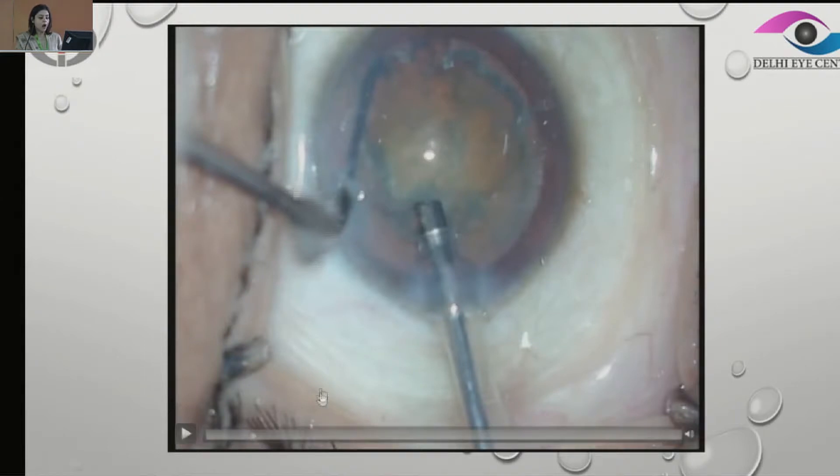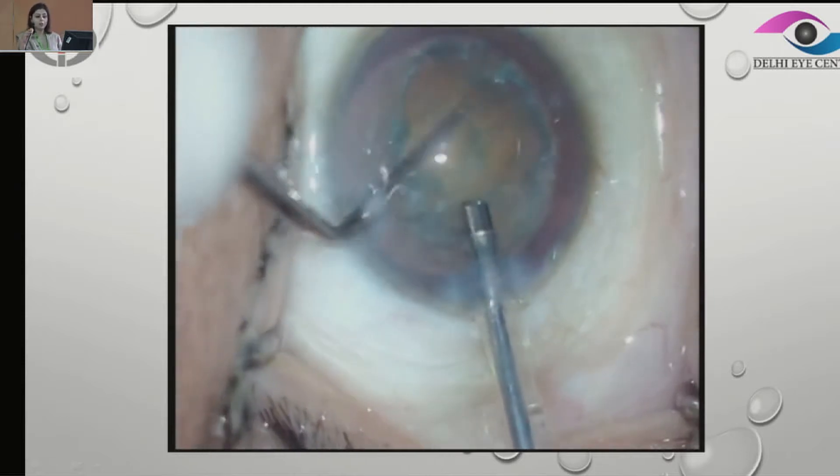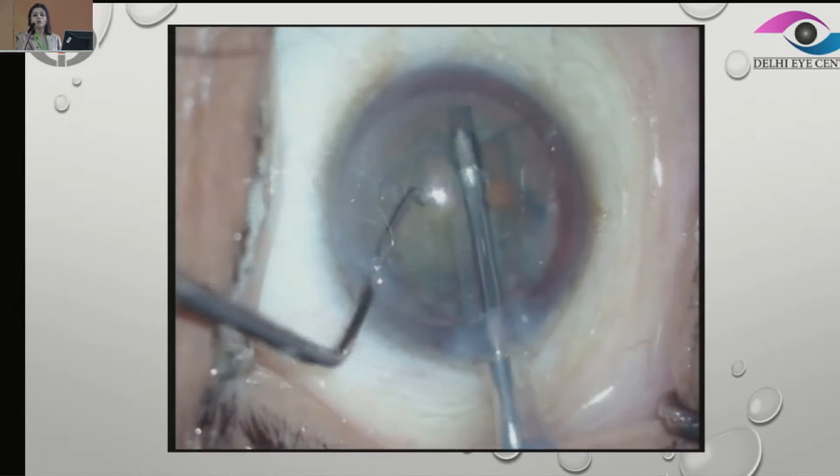So let's see how we can deal with these cataracts. This is one of the videos — it's a soft cataract in a relatively younger patient. What we are doing here is rotating the nucleus and making sure that apart from removing all the loose cortical matter.